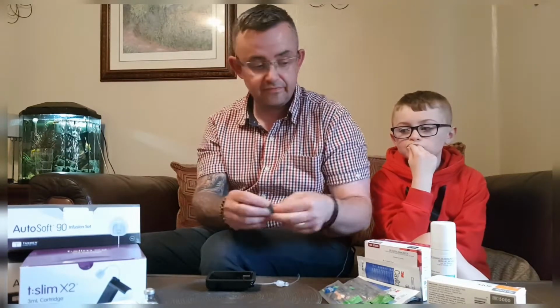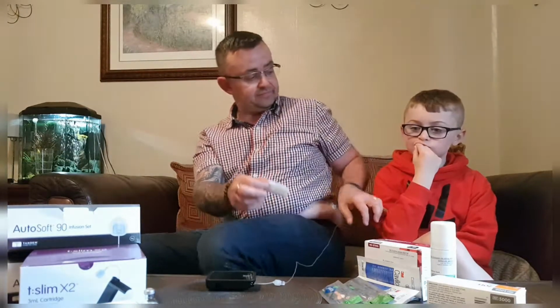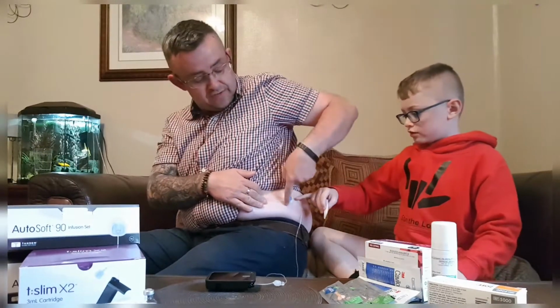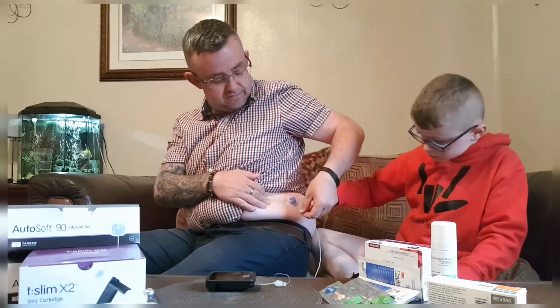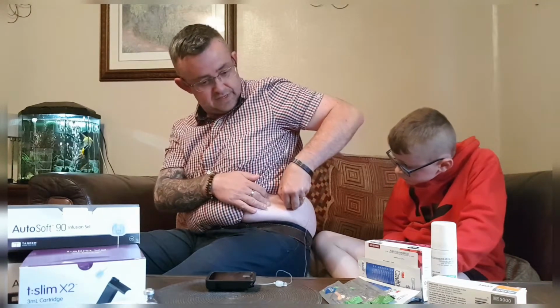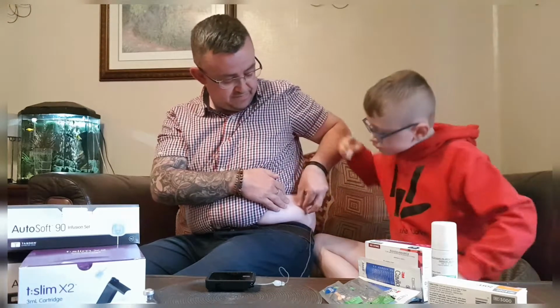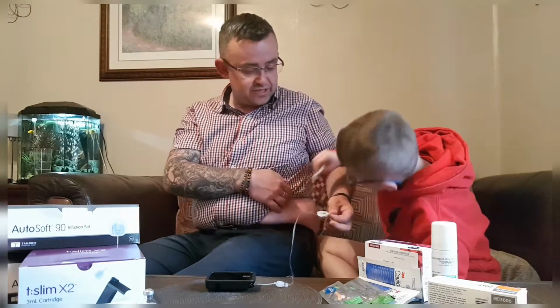So, do you want to do this? Yeah. Right, so take this. And then rub it on there. Around the plaster. Around it. That's it. Yeah. And then when I get a pickle of an edge, it's easier to get it to soak in. So now wipe just there. Can everybody see? Keep going. Because you have to do it as you're peeling it. There we go. Straight off.